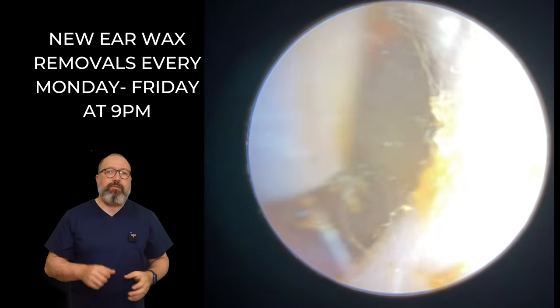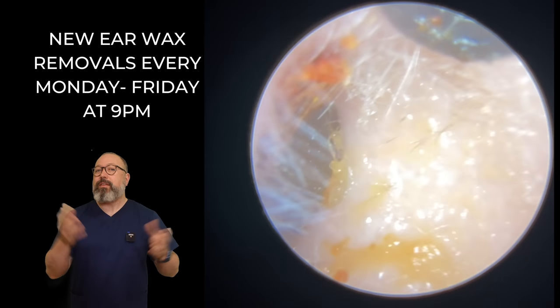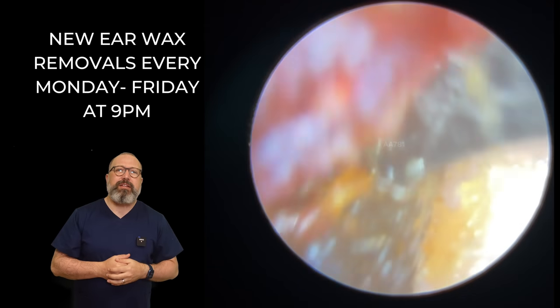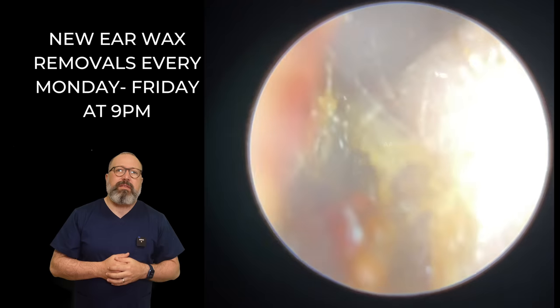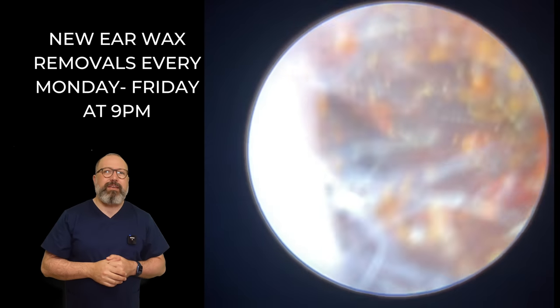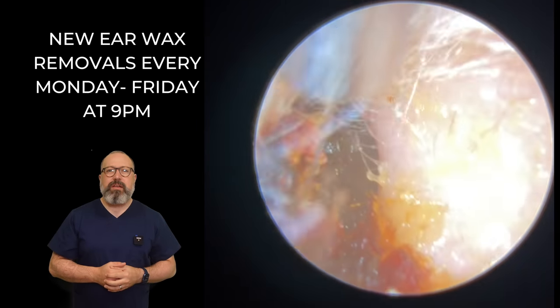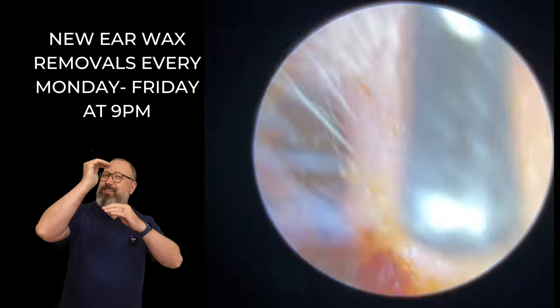That's great for getting this out — you tend to get a really good grip on that underside. So we've pulled it forwards now and almost wedged it there. If we did want to go in now with the Jobson horn, now's the opportunity. Let's see — we can kind of push up against the top of the canal and see if we can get beyond this plug. Gently trying to get through there. View just slightly obscured now from that front section, so we just pop that down there. Now we're behind it. So we're just going to start to pull this forwards. You can see it's quite thick. It goes almost brittle when it gets to this kind of consistency. It is starting to come away though. We're just stuck on this left-hand side — going to try and free that up. I can see a little bit of light at the end of the tunnel, just above the wax there is a tiny gap.